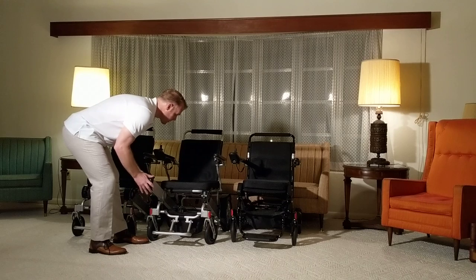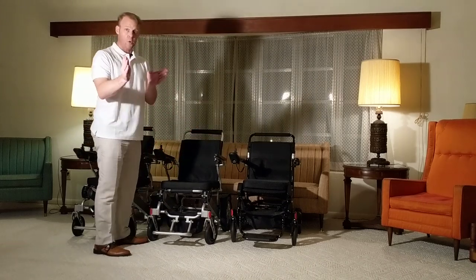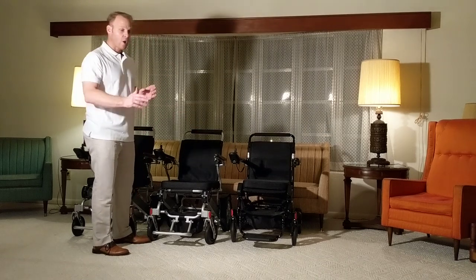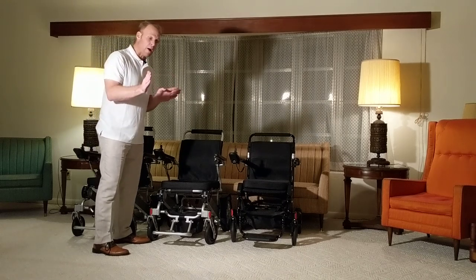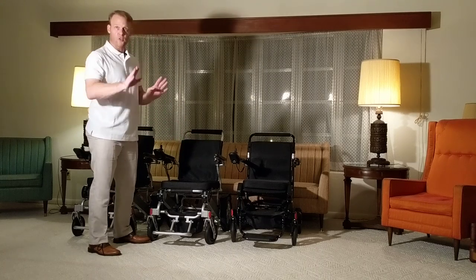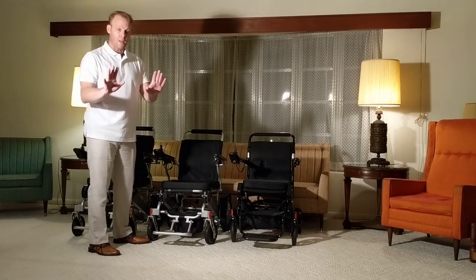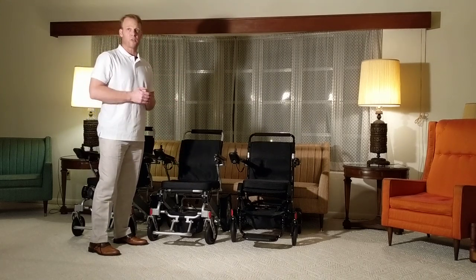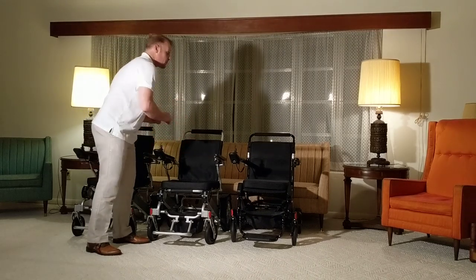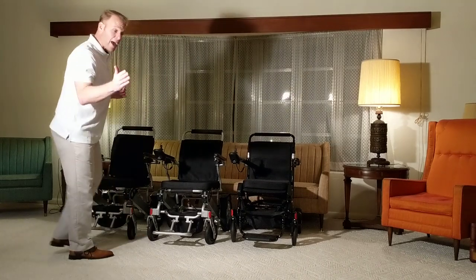Unlike the Airhawk, which holds up to 265 pounds, the refurbished AHXLS holds up to 400 pounds. The seating area — the space between the armrests — is approximately 19 inches. This chair has some benefits and advantages that the Airhawk does not have.